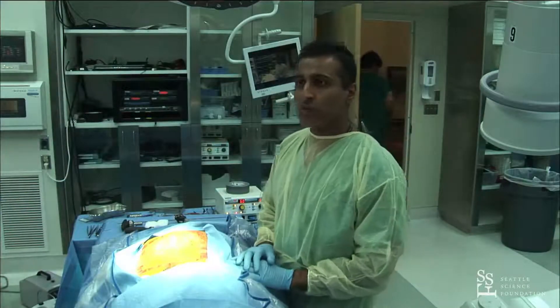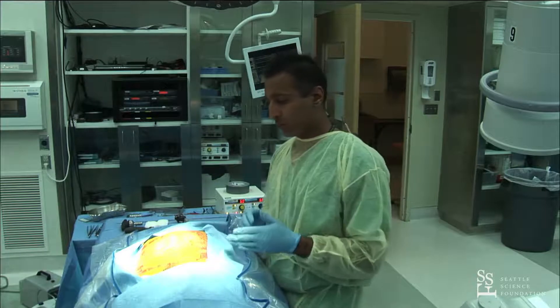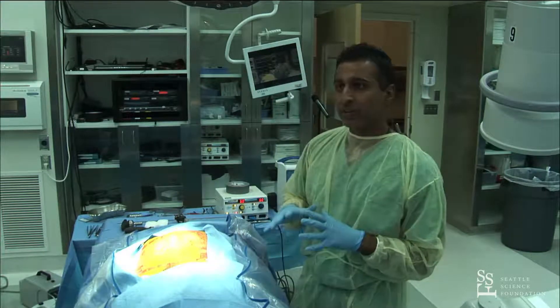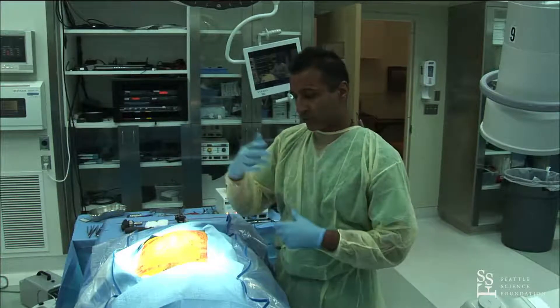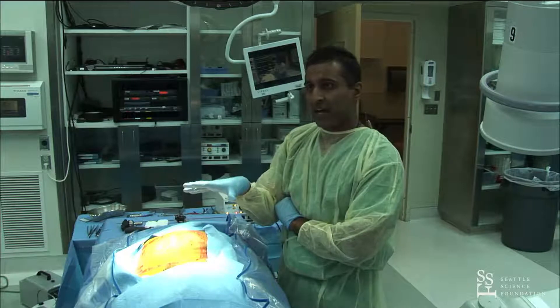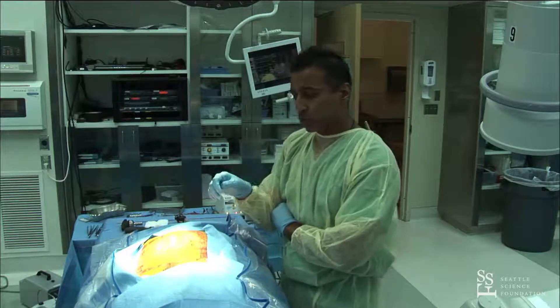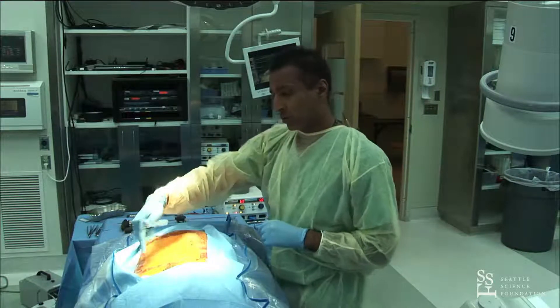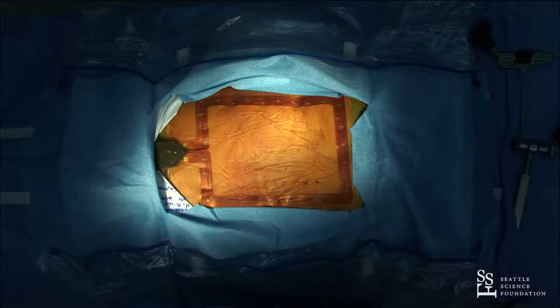I use navigation for most of my practice at this point. We're going to do lumbar pedicle screws from L3 to S1. What you're not seeing is the Ziem, which is the portion where we do the spin. This cadaver has already had the spin done, so we're going right to the navigated screws. We're looking at the Stryker spine mask, which is a skin-based tracking system for navigation.